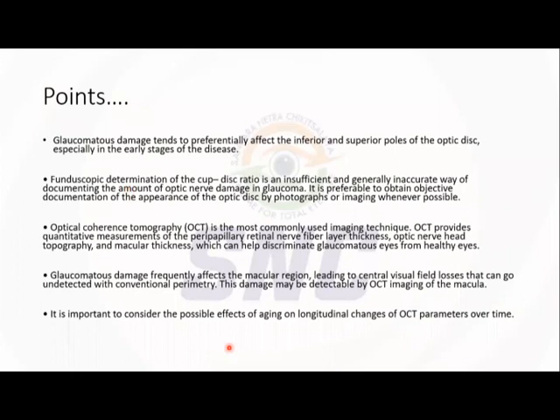Whether it is a good quality report, the image, is there any movement of the eye when we are taking the image? So a lot of things are there in the OCT report. Sir, whenever you have time, just try to read OCT, ONH, RNFL, and GCC. I thought you would be focusing more on this part. You have to focus, but sir, it is a generalized topic.